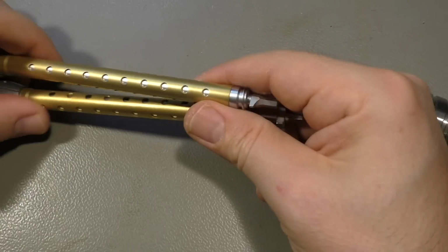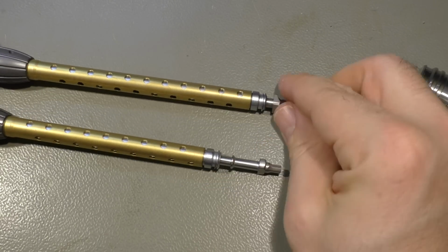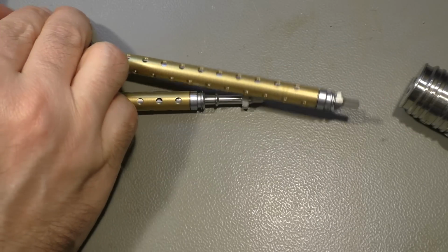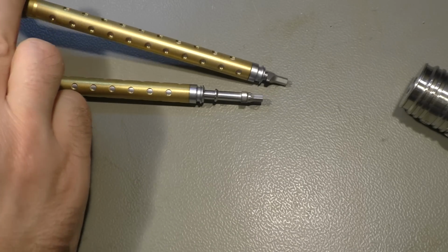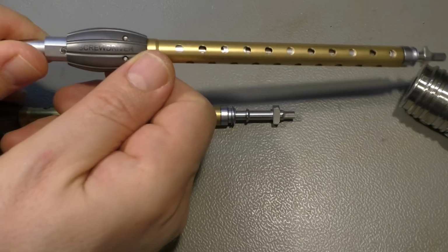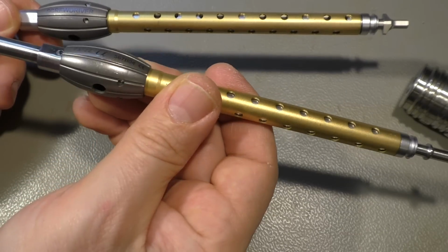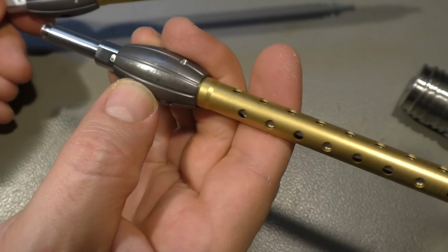There are two types of this polyaxial screwdriver. That's the high top version, and that's the normal version. The function is the same. You turn that and the tip turns around, and if you turn that grip here, that thread here, that screw turns around. It's also marked screwdriver, so that everyone knows what it is used for. There is also a number. I don't know if you can see that. And it's called the high top screwdriver. Of course, it has a higher top here. Whatever that exactly means.